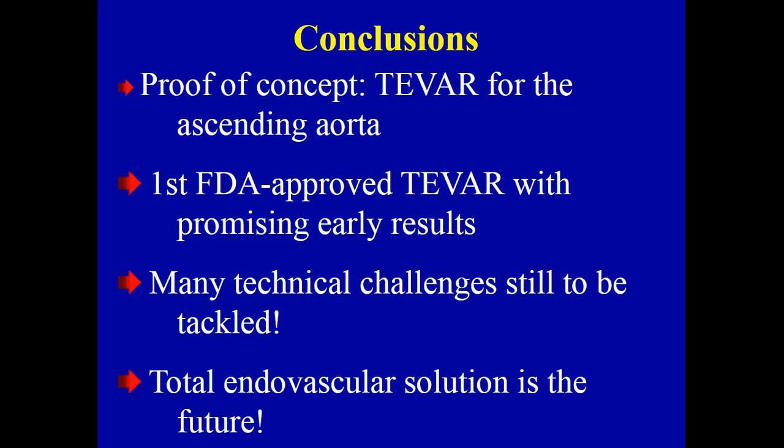There are still many technical challenges to be tackled, specifically the coaxiality of the stent graft in the ascending aorta, and I think the total endovascular solution will be the future. Thank you.